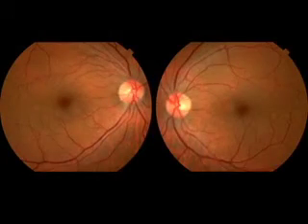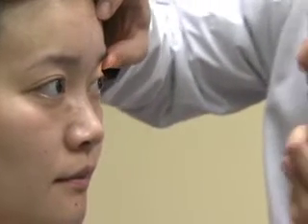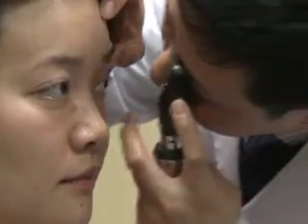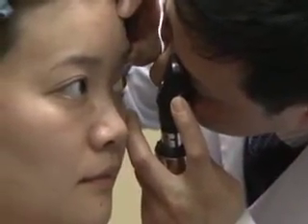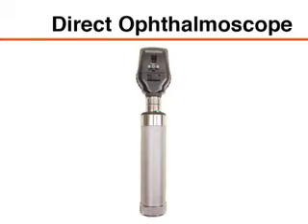In the human body, only the retina allows the examiner to achieve direct visualization of the central nervous system and the vasculature. Therefore, the fundoscopic examination is important in the detection of certain systemic diseases and diseases that primarily affect the eye. For non-ophthalmologists, the direct ophthalmoscope is the preferred instrument for examination of the retina.